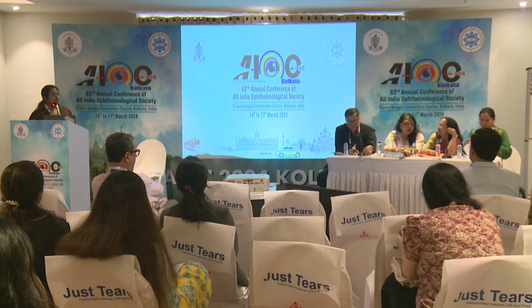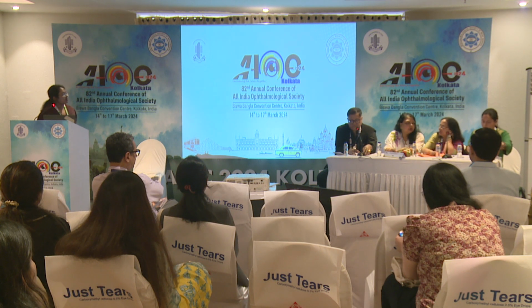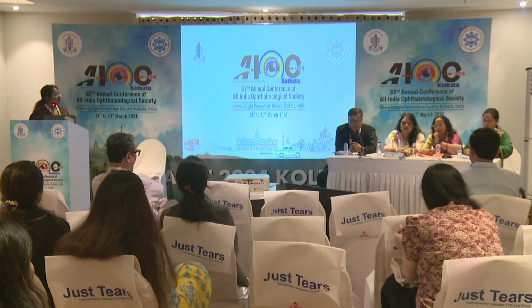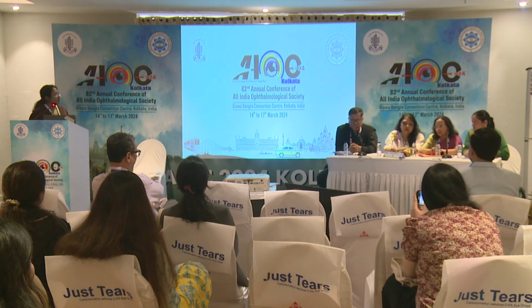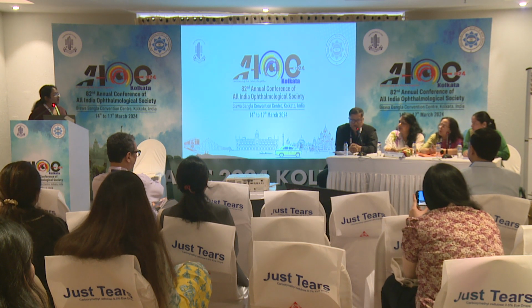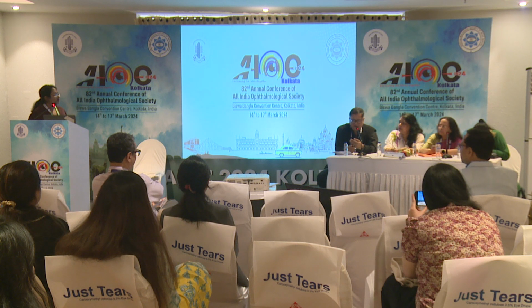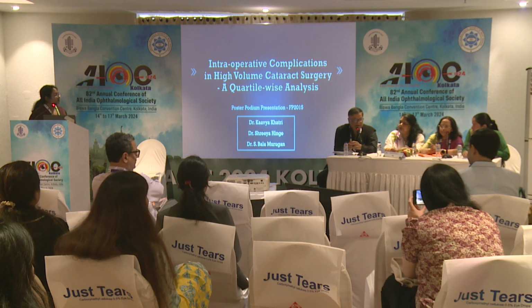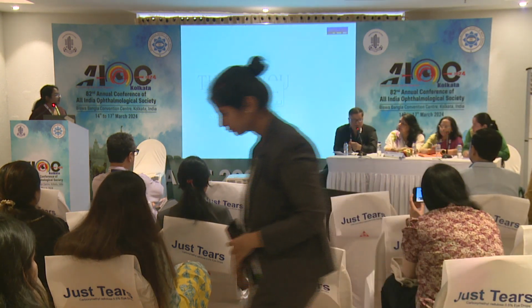For soft cataract, do you need all this difficult instrumentation, because that is going to increase the chance of complications, no? What is your opinion? Intralenticular manipulations, when you can do a very nice aspiration of the center and then tuck the nucleus so nicely in a single flip.